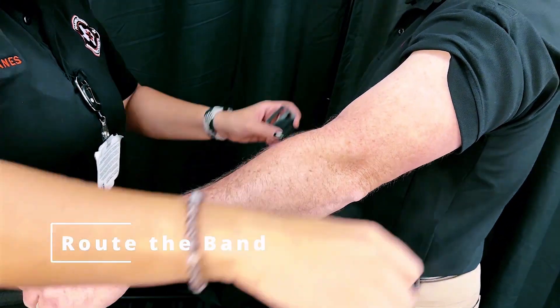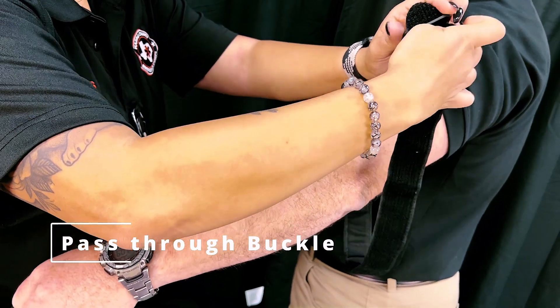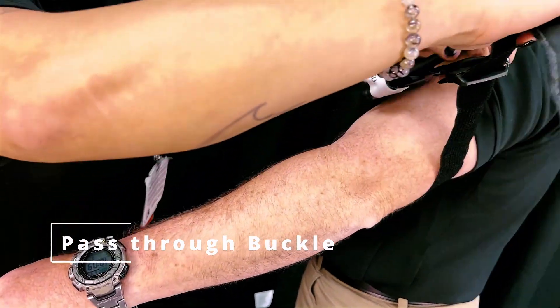First, route the band around the affected extremity. Pass the band through the slit of the buckle and position the CAT two to three inches above the bleeding site, directly on the skin.